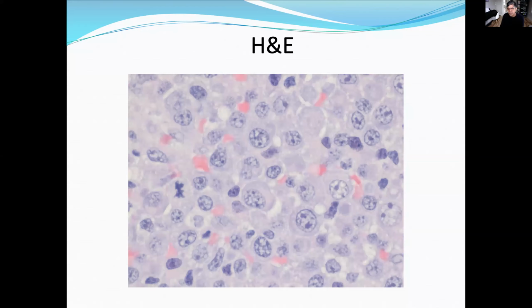Hematopoietic or not? Any charts? Anybody? Or is it a carcinoma? No? Okay, let's keep going.